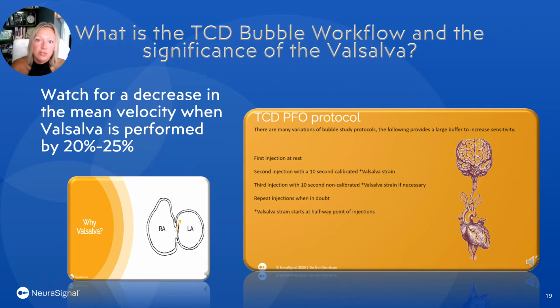To ensure that Valsalva is performed properly, we will watch a decrease in the mean velocity, or we will select delta on the machine to see the percent decrease in that mean velocity during Valsalva. That mean velocity should decrease 20 to 25% as the patient is performing the Valsalva. And then once they release, that mean velocity should go higher on the screen. So we will make sure that our scale is high enough to capture that waveform as it increases with the Valsalva release.